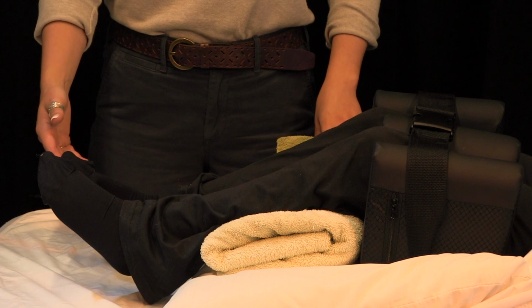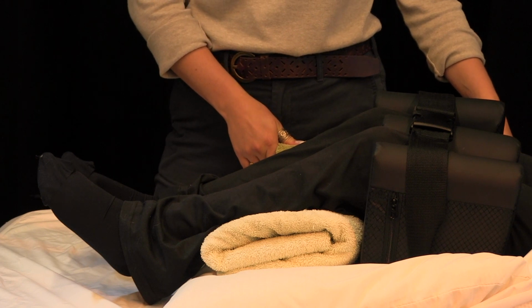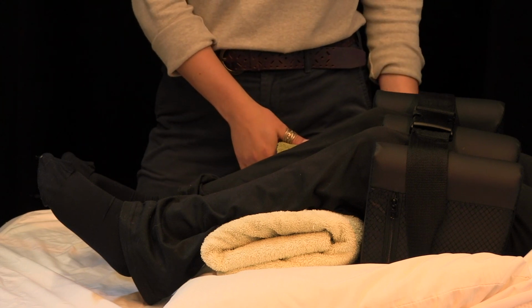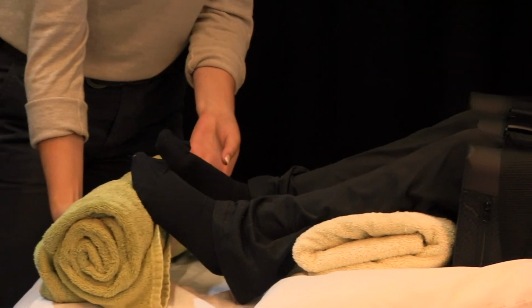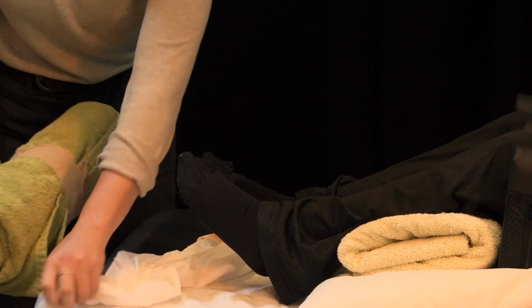Now we do have floating heels, but the feet don't have any support. Many people report increased comfort and stability of their feet and ankles if a small support is placed under the ball of the foot. This also helps prevent foot drop. I'll be placing this support under, we think it's about tall enough, and this can be placed under the sheet to keep it secure.